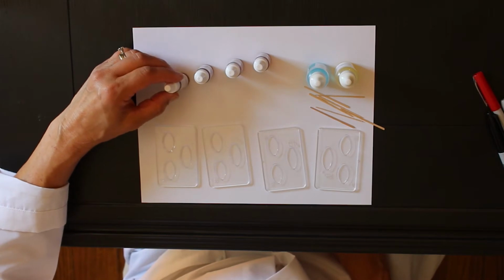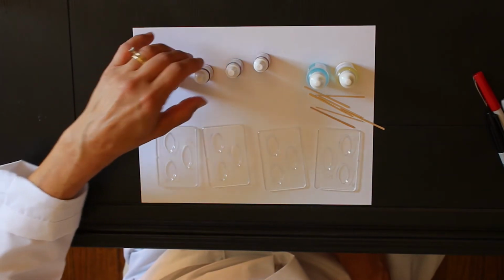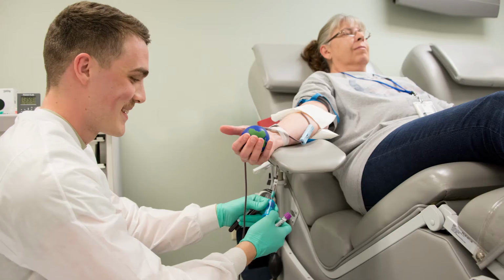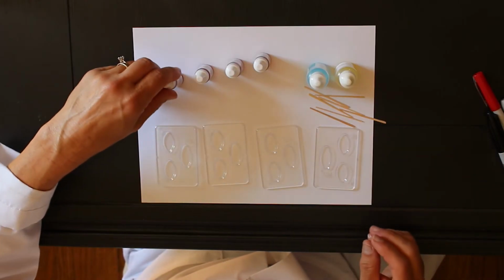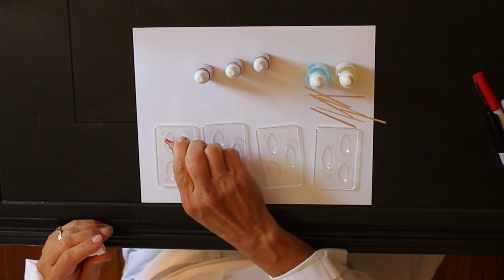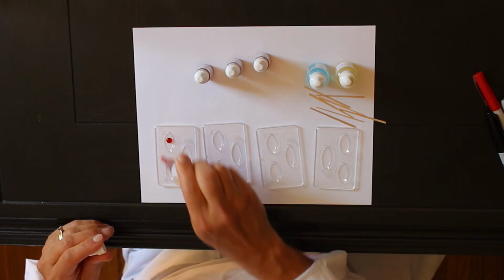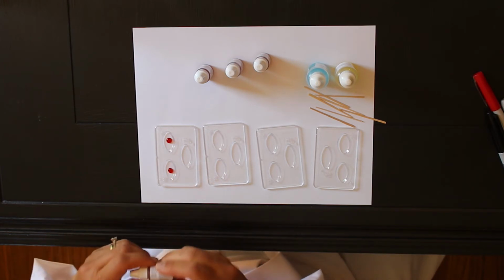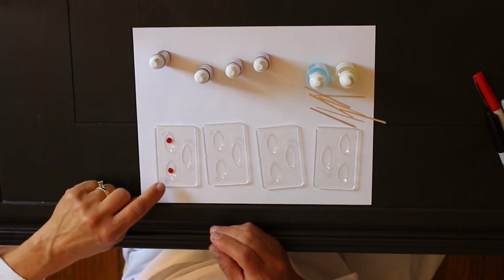So we've been given blood from 4 different donors, and we're going to determine the blood type of each of these donors and see which one would be the best one to give blood to someone that has type O blood. We do not want their blood to clump, and we want them to have a safe transfusion. So we will take a couple drops of donor 1, and put it in this little tray, a typing tray, in 2 wells. We're going to put it in an A well and a B well.